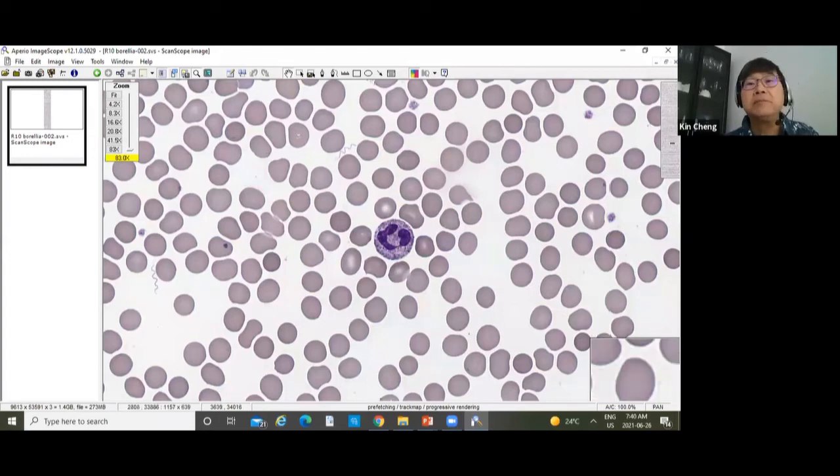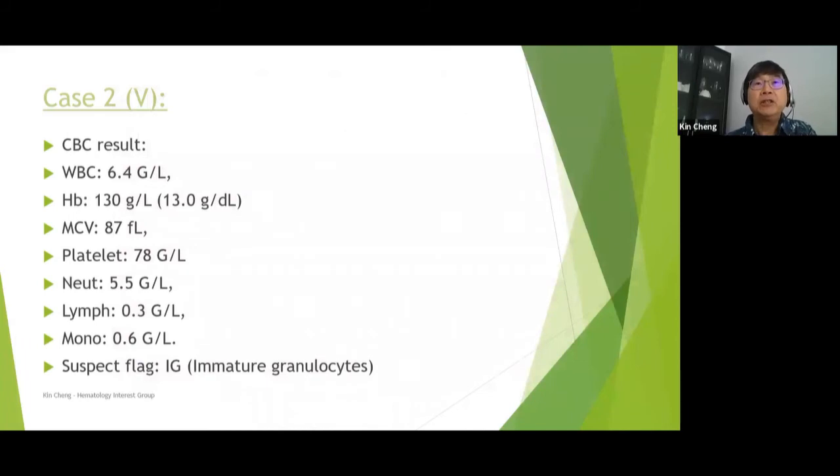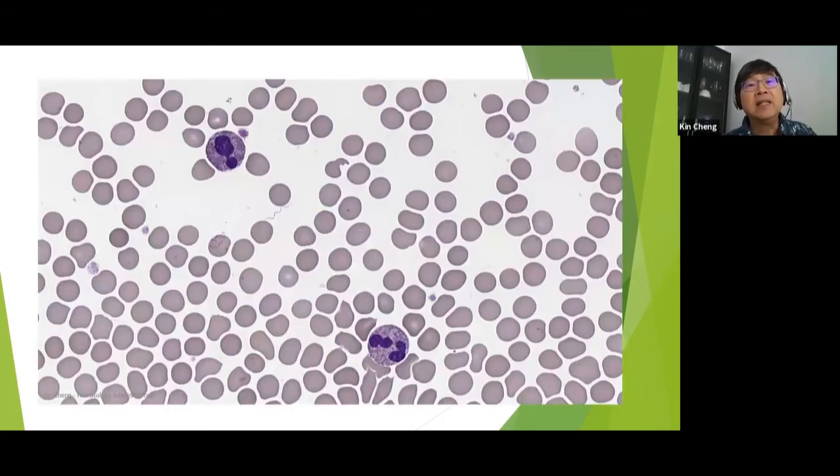And so I'm going to move that back and see if it will go back there. Okay. There we go. So in this case, the patient, now this technology is so good. I think this was her last shift of her career because she was going to retire the next day. And this really topped it off because she was able to find this bacteria and report it to the doctor that she found these spirochetes. And this is a still image. And again, it is right here. The spirochete is right here. Can you see? I hope you can see that, right?